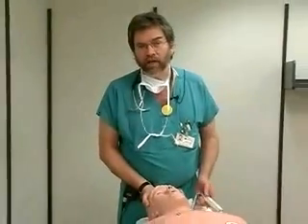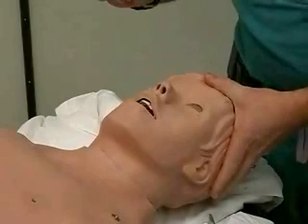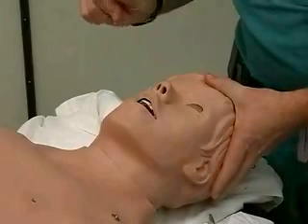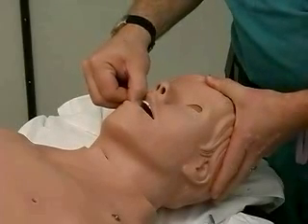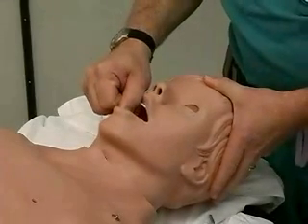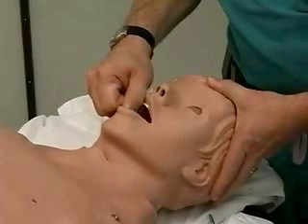Once we're in the sniff position, we're going to gently extend the head further, and most typically the mouth will open in the unconscious patient. If not, we'll use a scissors maneuver. This is simply done by taking the right hand, crossing the thumb over the finger, inserting it into the mouth — obviously a gloved hand on the actual patient — applying force, and you can see how easily I can open the mouth with minimal effort.